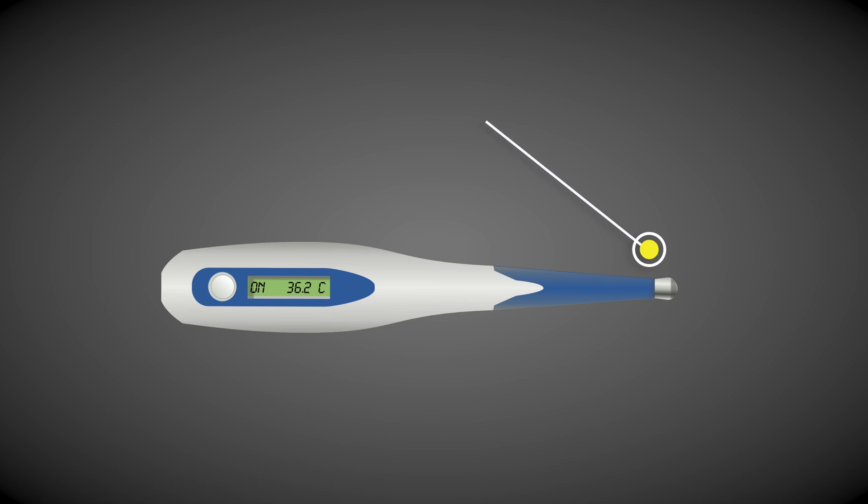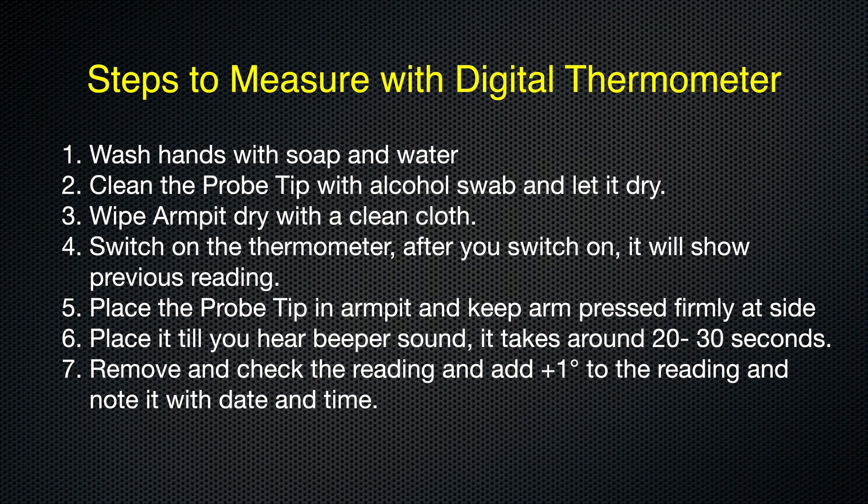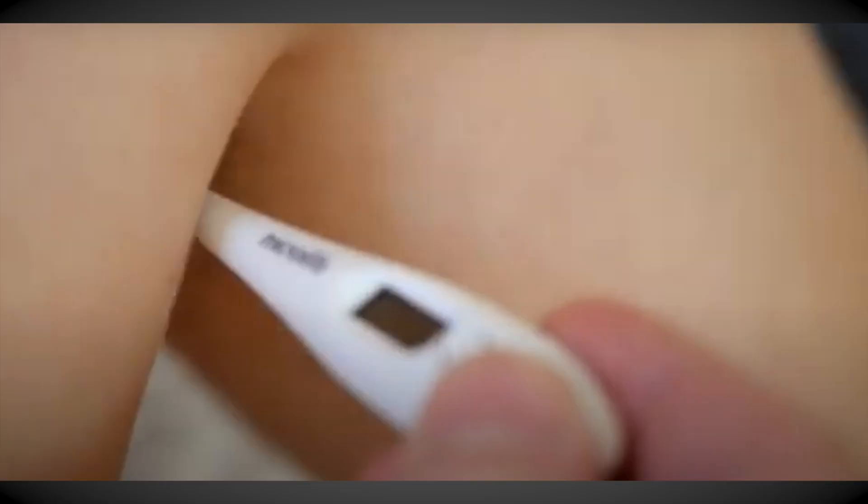While you wash your hands with soap and water, it's important to clean the probe tip of the digital thermometer with a sanitizer and allow it to dry. This is the probe tip — clean it with sanitizer, allow it to dry, and wipe dry with a clean cloth. When you switch on the thermometer, it will beep showing you the previous reading.